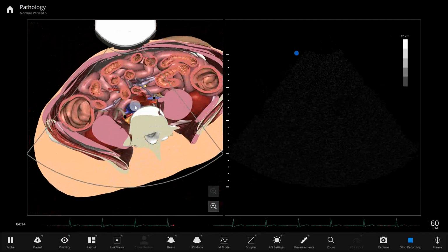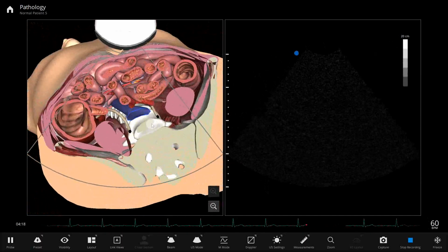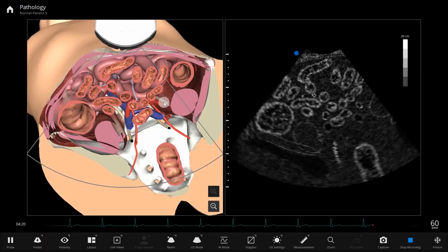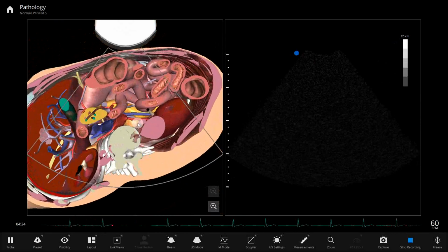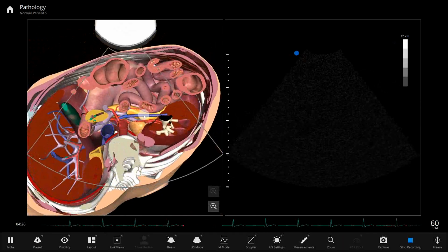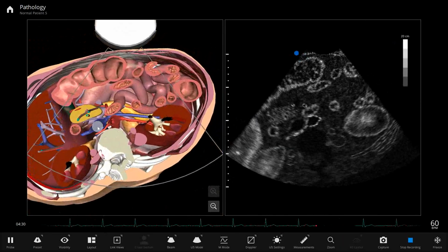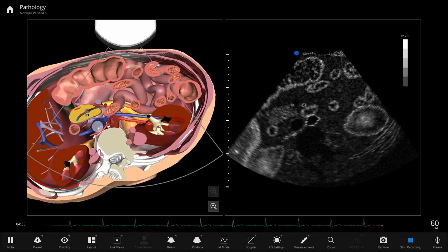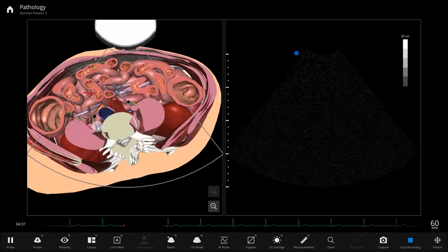On the left side, the left testicular vein, the left ovarian vein, they're going to enter the left renal vein. They will branch into and dump into this left renal vein. And then the left renal vein will join the IVC. And that's how the left gonadal blood supply gets back to the IVC. Okay, that takes care of the IVC.